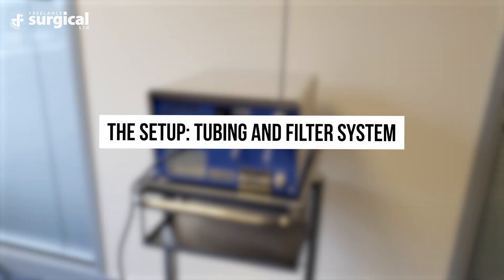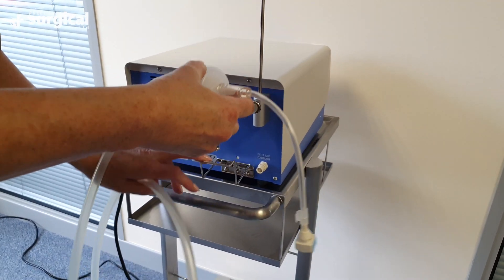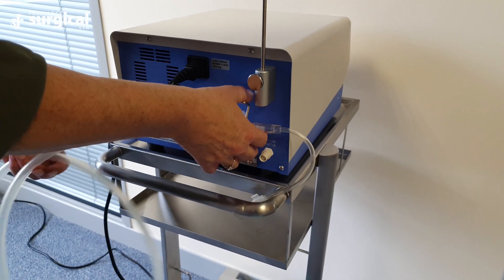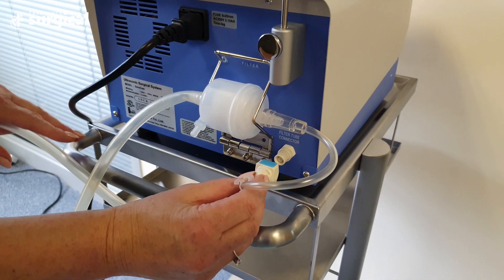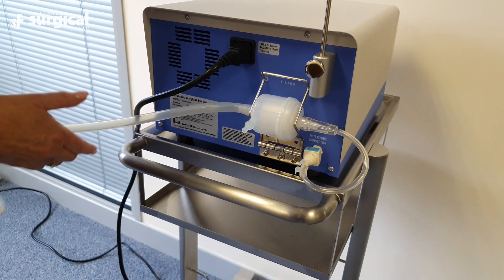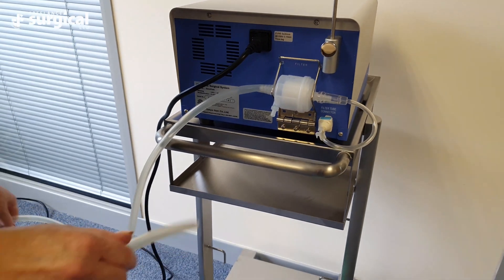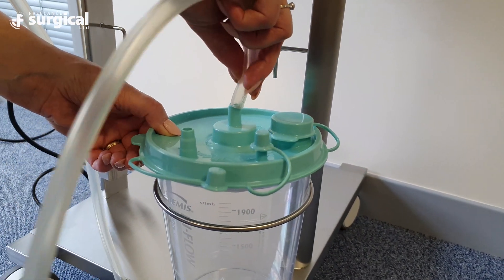The following steps are to help guide you through the setup of the Sonicure tubing and filter system. Attach the suction filter to the back of the Sonicure generator. Ensure that the barrel of the filter fits firmly into the metal clip and attach the blue connector onto the connector port on the right hand side of the generator. Attach the filter tubing to the vacuum port in the centre of the suction bottle.